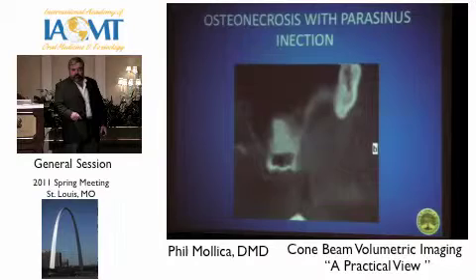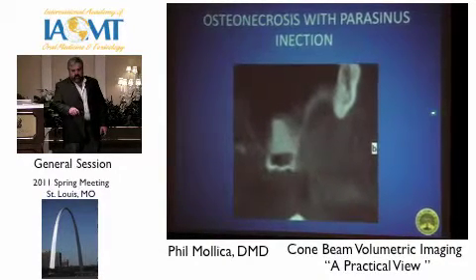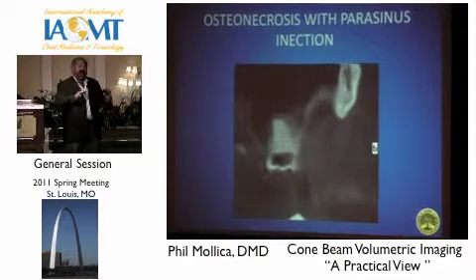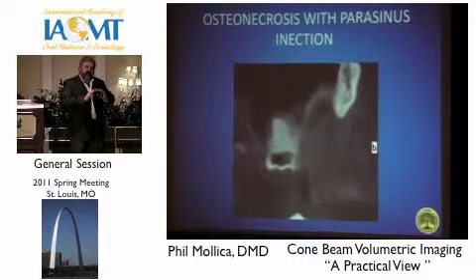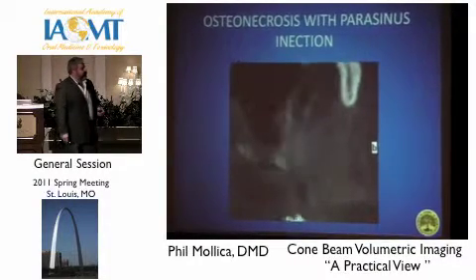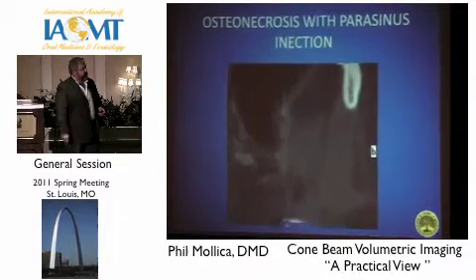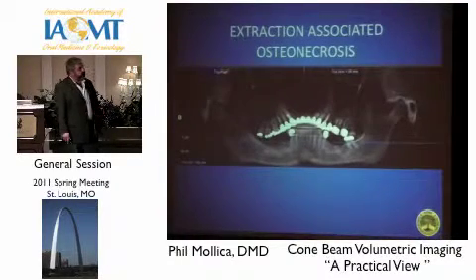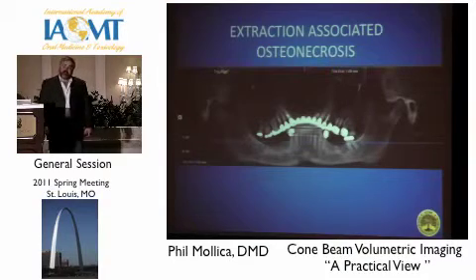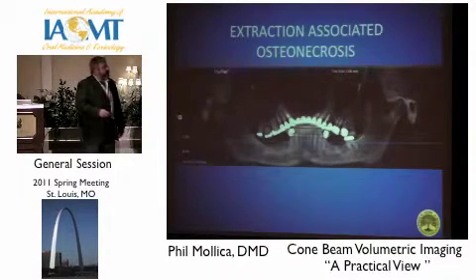As we work our way through, look at the hole in this tooth and the associated infection up in the sinus. Remember, with infection, we look at foci of infection. Infection's everywhere, okay? It's just how much is in a particular area. So when we think this little spot's infected, it's much more dispersed than that. And once again, we're going distal past that. We can see the raggedy bone here, and we can measure these densities, and we will when he gets back. Now, that's interesting. Now, correlation, that things aren't just right where they are.